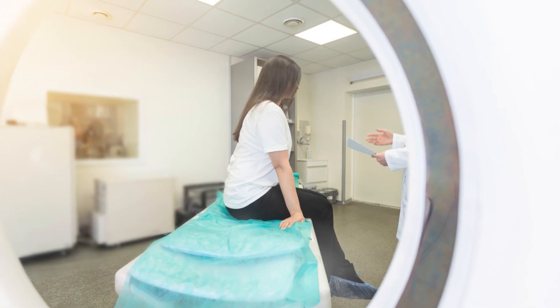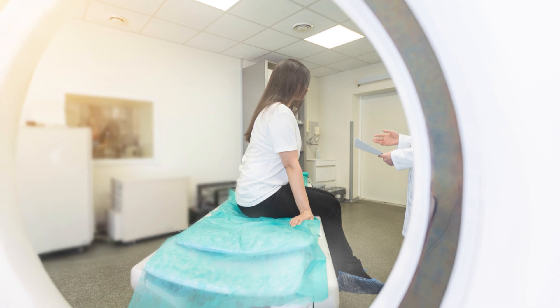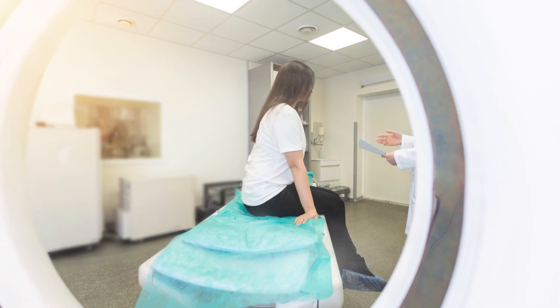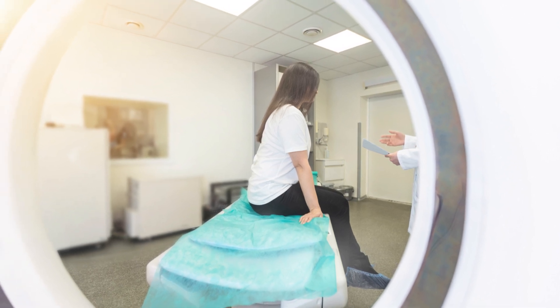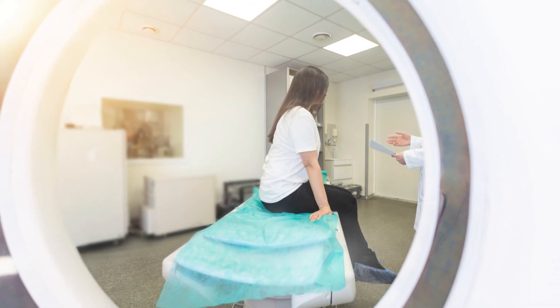For instance, a malfunctioning x-ray tube can lead to poor image quality, while a faulty detector might result in image artefacts.